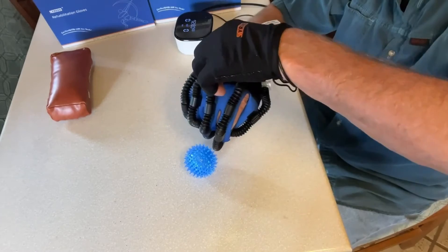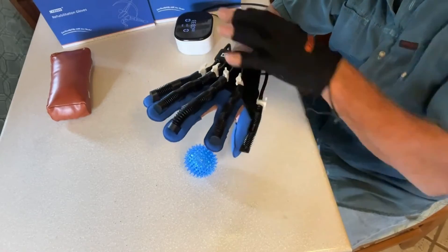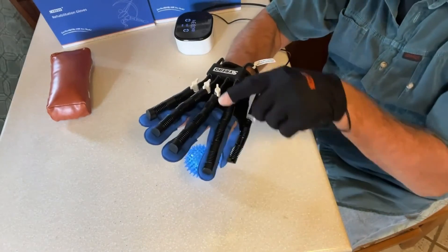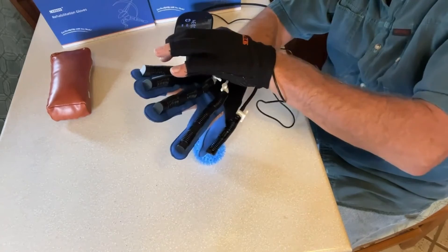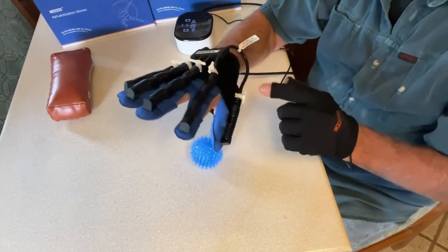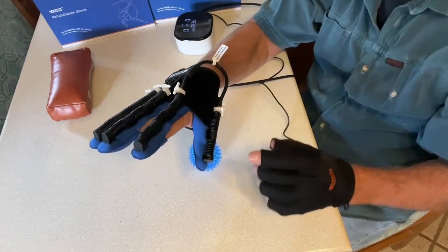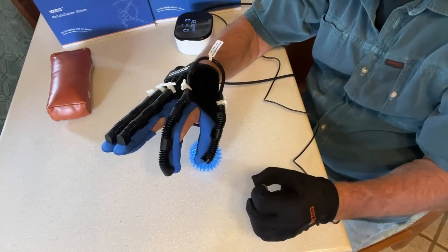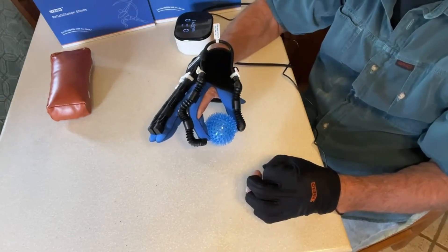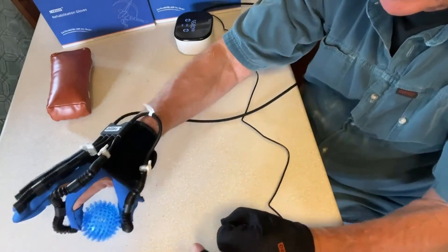What happened was I couldn't straighten them out. It's all fun and games till you need one — you can't do this. So I've got three fingers shut off; I only have my pointer finger and my thumb that are going to be activated. And if I pinch, it pinches — but those three didn't move. So I can pinch the ball and drop the ball — whoa, did you see that? I caught the ball!